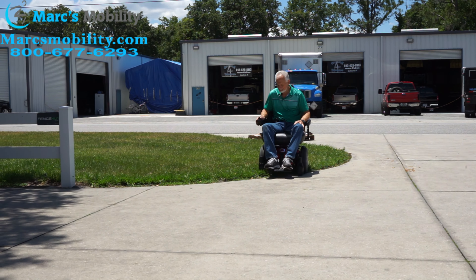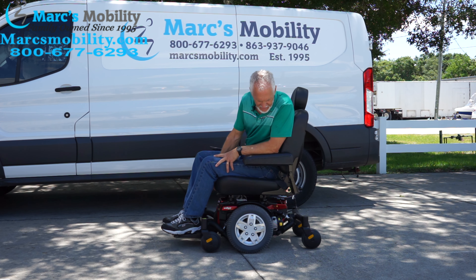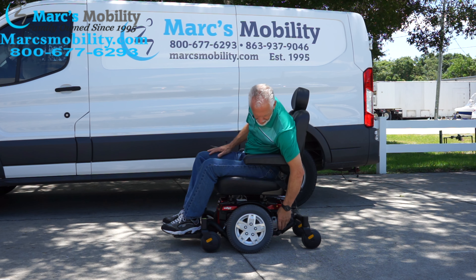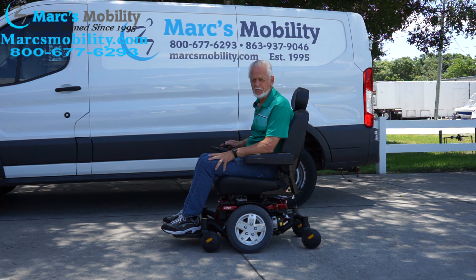This is the chair that was only used for two or three months at the most — it's practically brand new. It has the 23-inch by 20-inch deep seat, the large seat. It has the flip-up arms and the HD motors right here. So if you need a heavy duty power chair with a large seat, this would be a nice one.